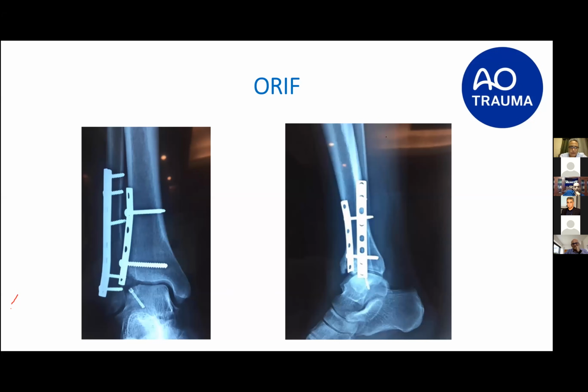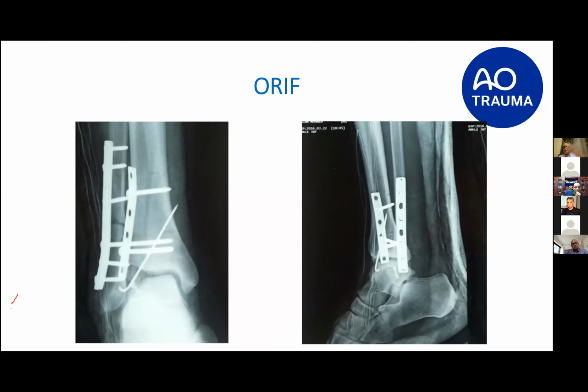Any comments about the procedure? Yeah, did you start with the fracture of the talus first, to make use of the room? Yes, because your view is clearer before you reduce the tibial plafond. So the first thing I did, after the exposure and the dissection, I fixed the talus. Then I went sequentially to the plafond, the talo-fibular, and this is the last one to be done.